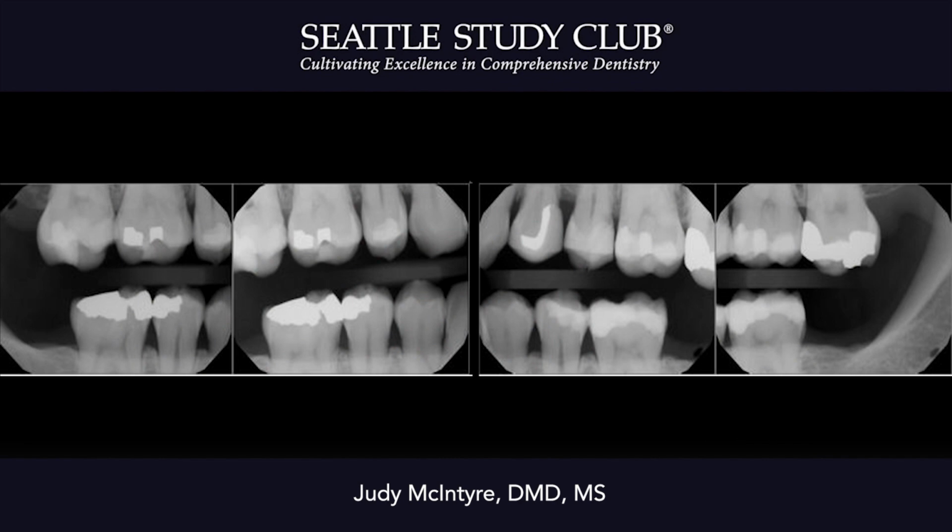So in this first case, as you'll see, when a patient is referred to us endodontists, me specifically, I often get bite wings sent over. And I'm really confused. Why is a patient being referred based on bite wings? Maybe they have pain, but shouldn't the restorative dentist, shouldn't their dental home be taking a PA before they send over? It could be a crack. It could be a popcorn kernel. It could be unrestorable. So once again, the importance of x-rays seemingly is of utmost concern when there is any discomfort or where there is a referral outside of the dental home.